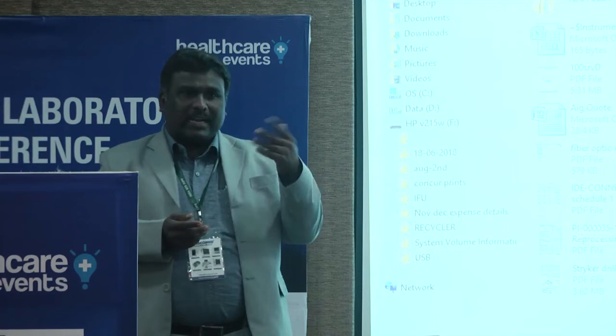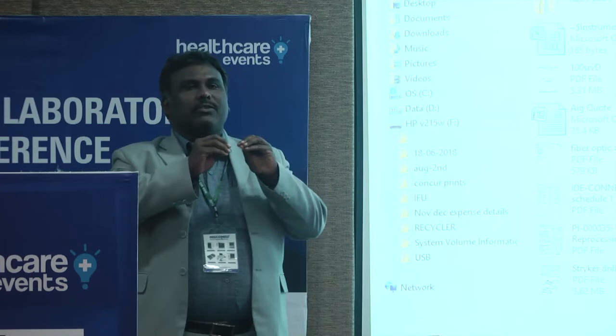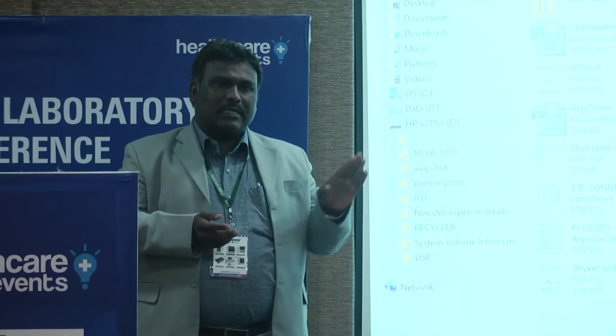The second biggest disadvantage is that it is a known carcinogen. Along with the instrument, something else is carcinogenic. When ethylene oxide comes in contact with water, the outcome is glycol, which is a known carcinogen. So that is why the industry has completely banned the use of ethylene oxide. Because of financial concerns in India, we still recommend ETO as an alternative choice.